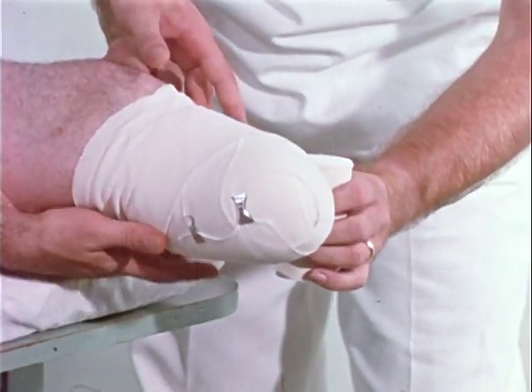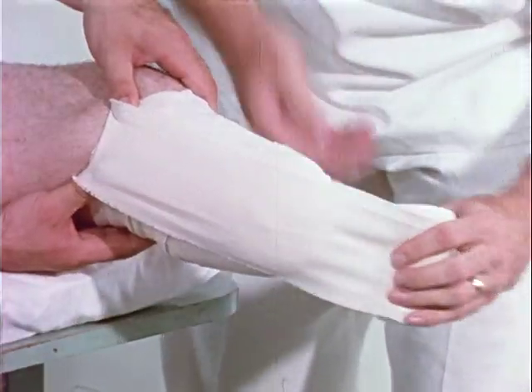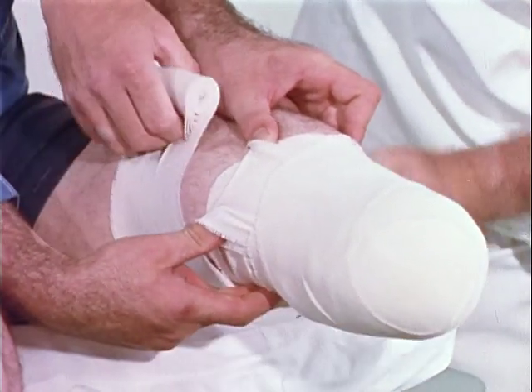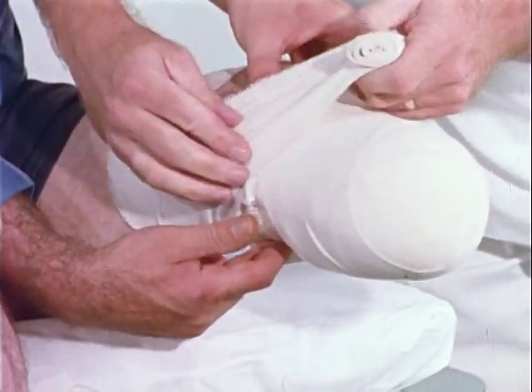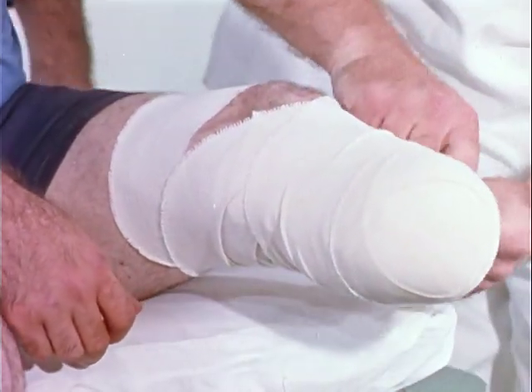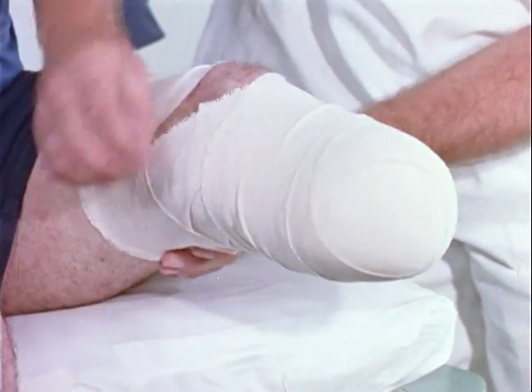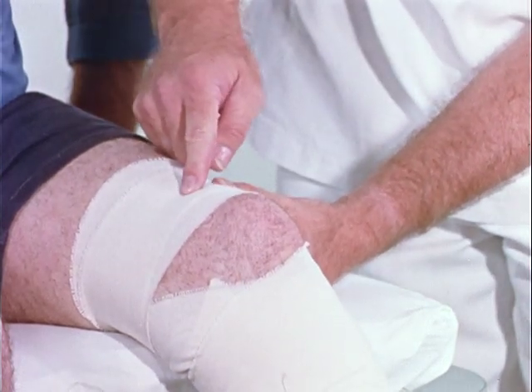The second bandage utilizes recurrence from the lateral to the medial aspects of the stump. The second bandage is secured above the knee and should include the femoral condyles, as these are contained within the patellar tendon-bearing prosthesis.